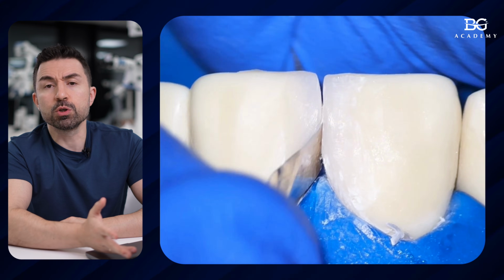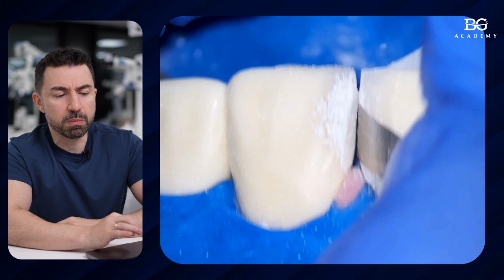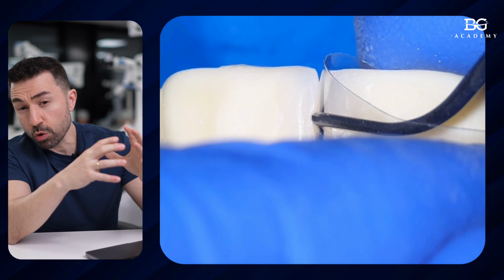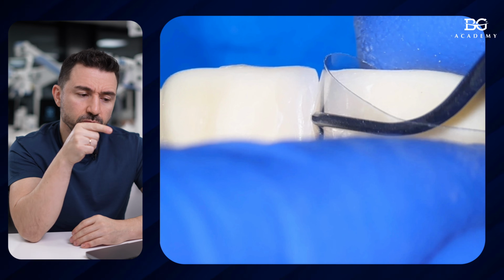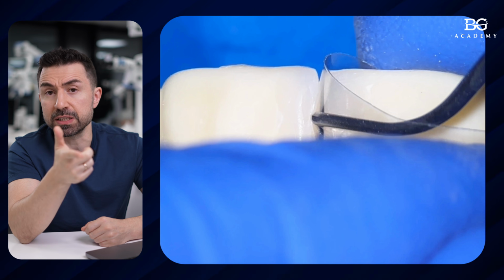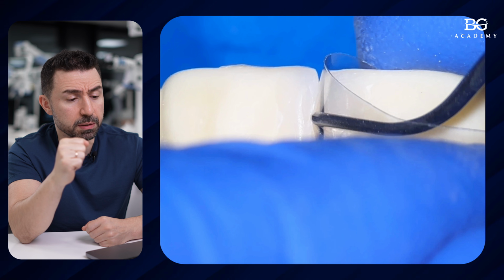First of all, we will have to create enough space, okay? So we take a strip, metal or plastic, and probably you will create a little bit more space on the tooth that is more progressive compared to the one that has negative contact. Then I prefer to use a wide celluloid transparent matrix, which I place to the tooth where I'm going to rebuild the interproximal contact.